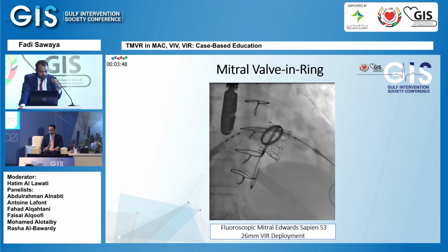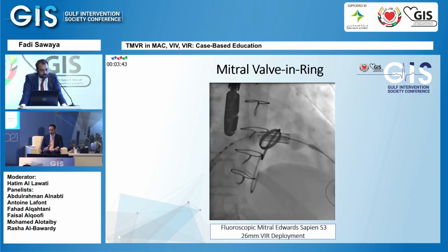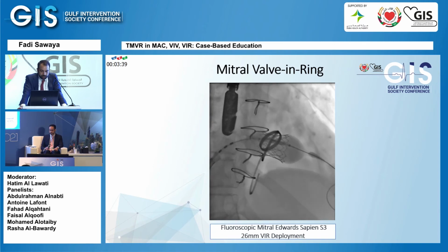Actually, I did this case with Dr. Ghazal here sitting in the audience. While he was deploying, I was actually pushing on the wire and pushing on the device to try to get as coaxial as possible.